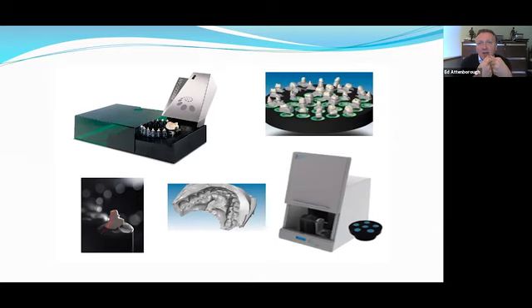Where you have more anatomy and you need more detailed surface registration, there will be a higher density of triangles, and where the anatomy is smoother and there's less detail, there'll be fewer triangles. So it's almost like a 3D optimized zip file, in that it uses the minimum amount of data necessary to represent the anatomy.